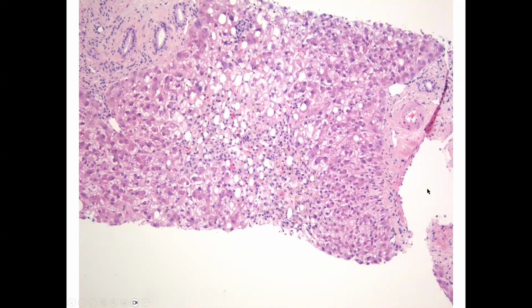Here you can more readily identify the portal tract structures of the portal vein, hepatic artery, and bile duct. And you can see that the hepatocytes around the portal tract are preserved. Some of them are a little bit swollen, so there's probably some injury here. Then as we go away from the portal tracts, to where the central vein is, all of a sudden you're like, where are the hepatocytes here? There's some dropout of hepatocytes. We no longer see that eosinophilic cytoplasm.